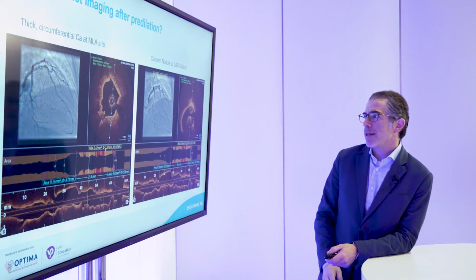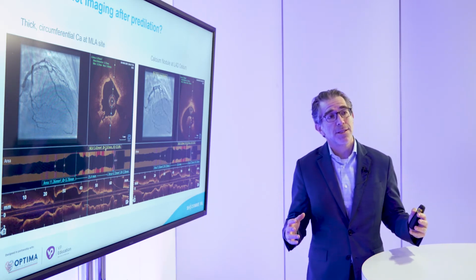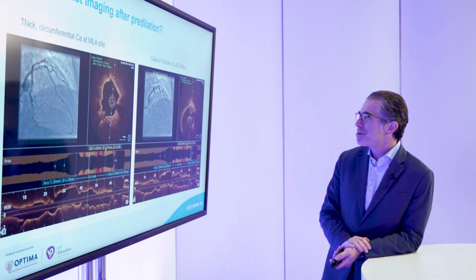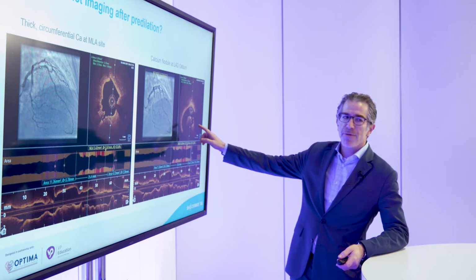caused by the IVL catheter, which is going to restore vessel compliance. So when I put in my stents, you'll get full stent expansion. Also, interestingly, in the ostium of the LAD, you see a calcified nodule.